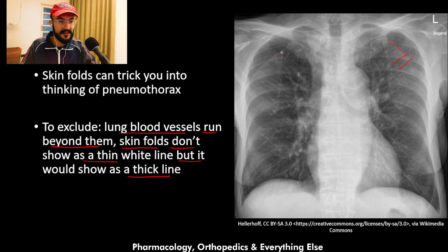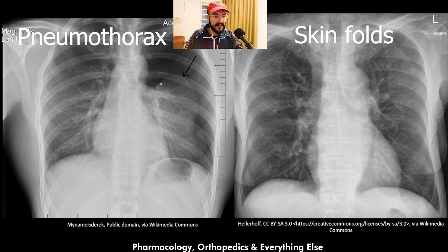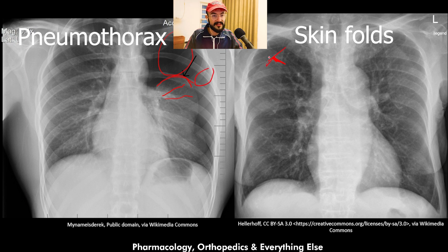As you can see, this skin fold line is quite thick. Comparing it to pneumothorax, the lung edge is a thin line while the skin fold is a thick line. In pneumothorax, you cannot see any lung markings beyond the lung edge — the area is black. But beyond a skin fold, there are lung markings visible on both sides of the line.